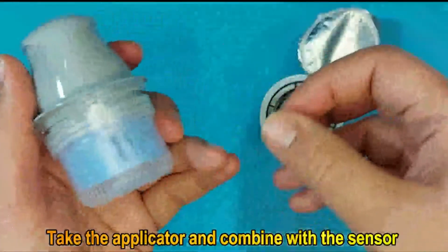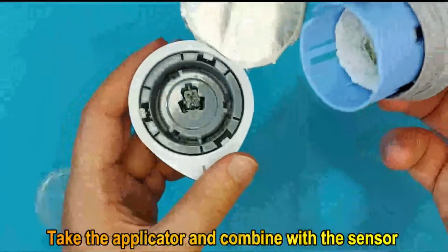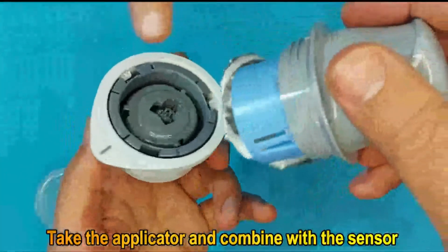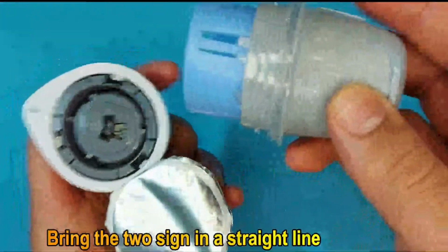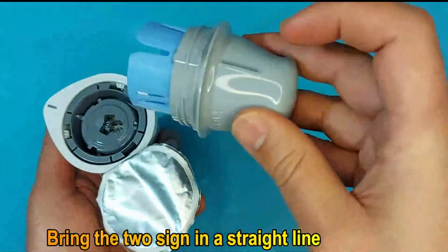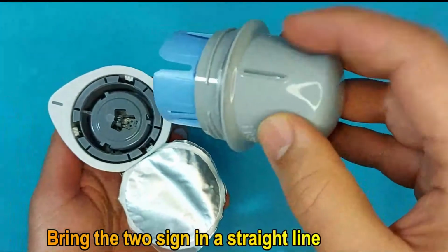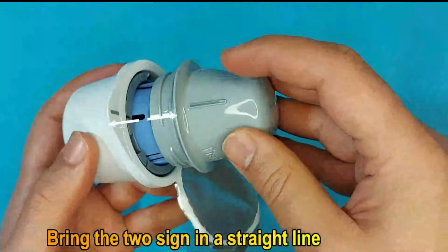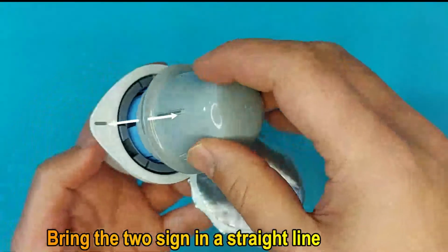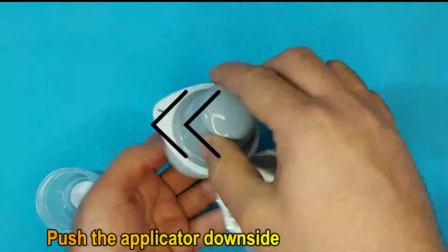Now take the applicator, remove the plastic cover and combine it with the sensor. You should take care of one thing here. There are lines on the sensor and also on the applicator. Bring these two signs in a straight line and then push the applicator downside onto the sensor. As you can see there, the sign on the sensor. So combine both in the same straight line and push the applicator downside into the sensor pack. Push it down, as you can see in the video.